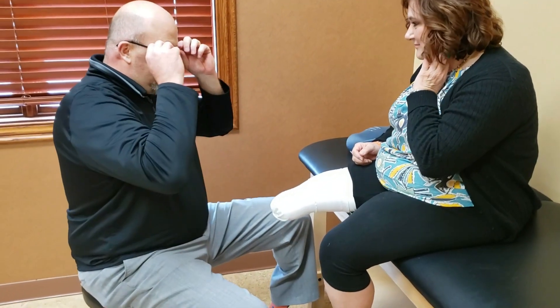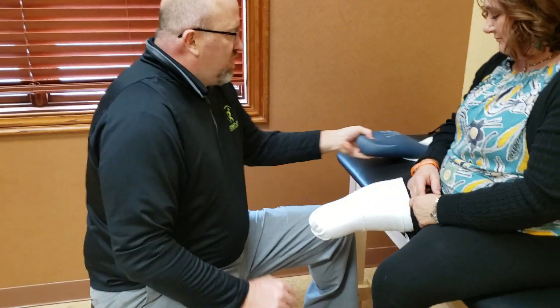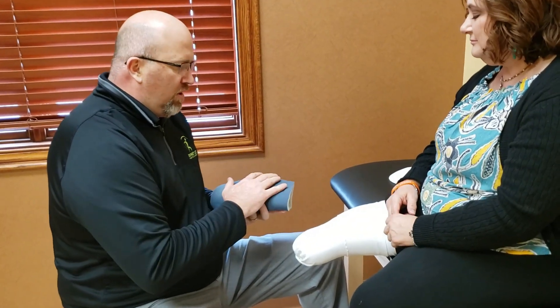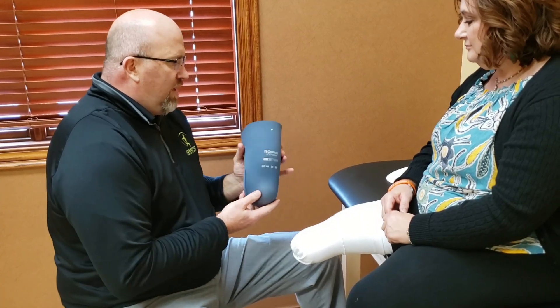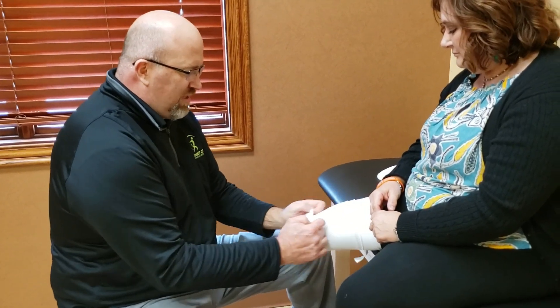This is the day you go home with your prosthesis. It also is potential information overload — a lot of new concepts are brought in. We're going to review the whole process: how we don the liner and put it in place, how we take it off, how we care for it, and the do's and don'ts.